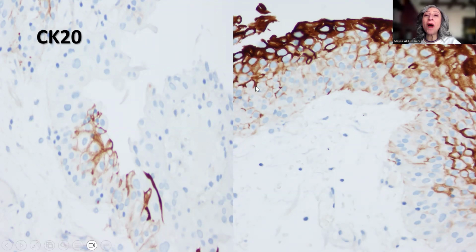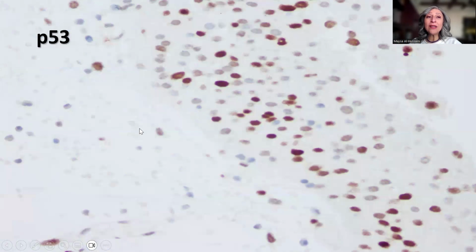slightly more widely expressed. However, this was only confined to the superficial layers of the epithelium, which gives some clue that this is probably only because of regenerative changes rather than a true dysplasia or atypia, because we do not really have full thickness involvement of the urothelium by cytokeratin 20.